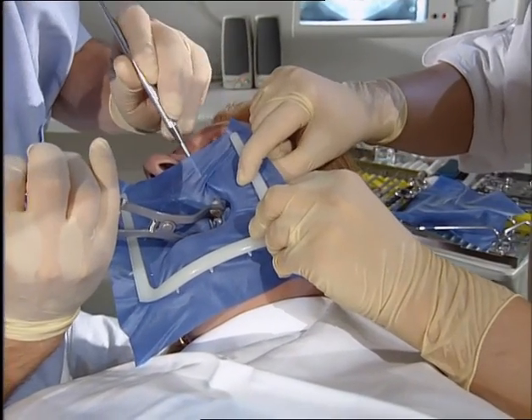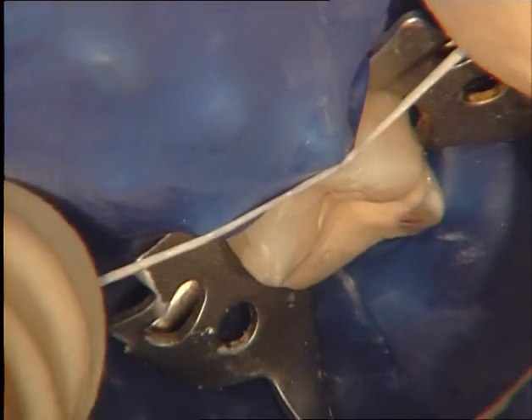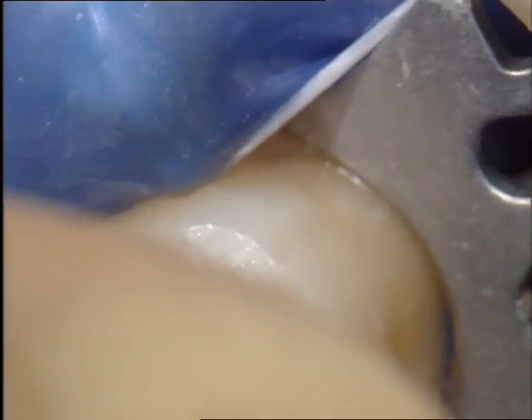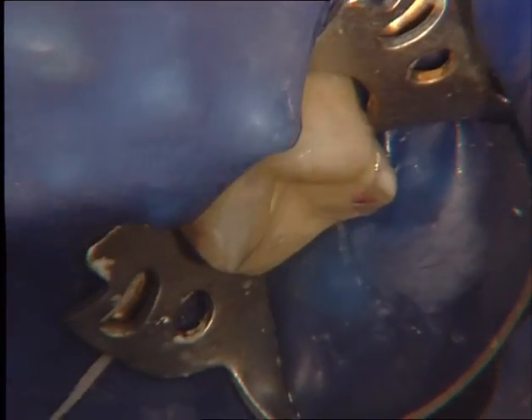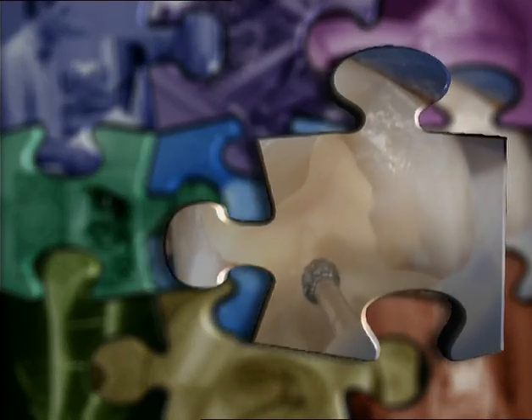In case of latex allergies, a non-latex rubber dam is available. In order to seal hermetically, the rubber dam has to be pushed through the interproximal contact point. There are clinical situations in which continuous minor leakage may occur. These often can be blocked with, for example, Cavit or oral seal caulking.